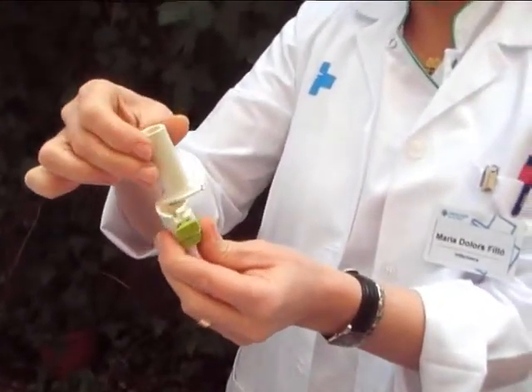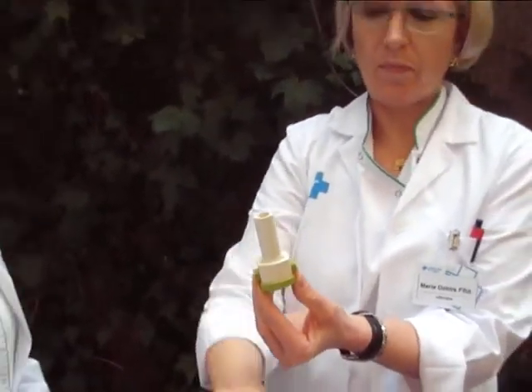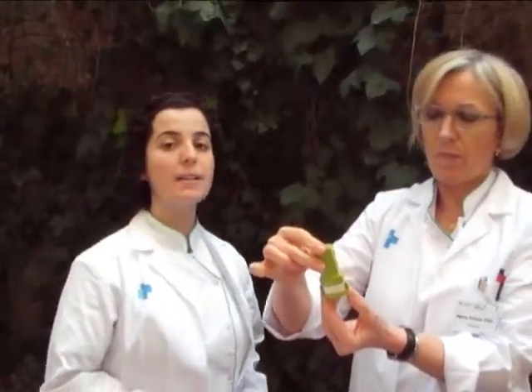Finally, put the cap back and rinse out your mouth with water.